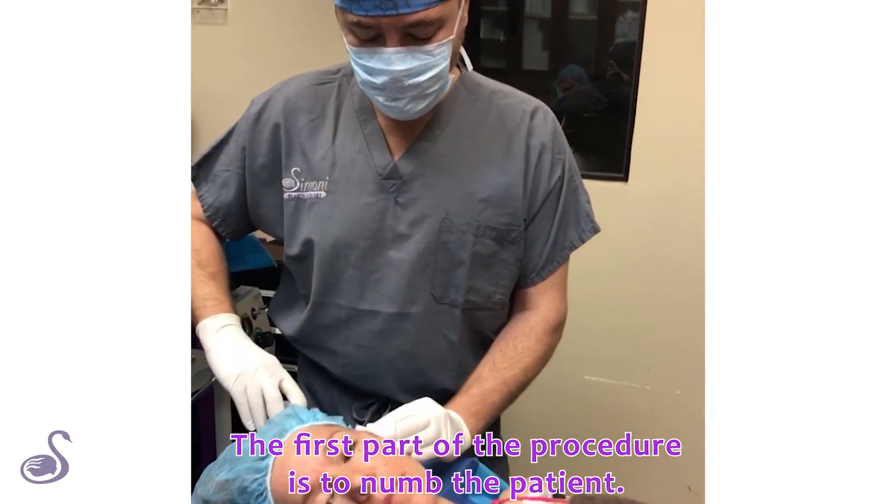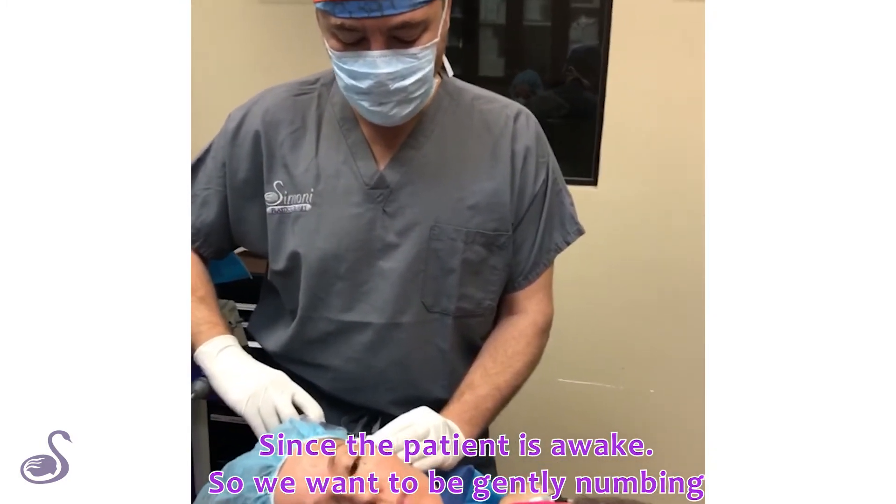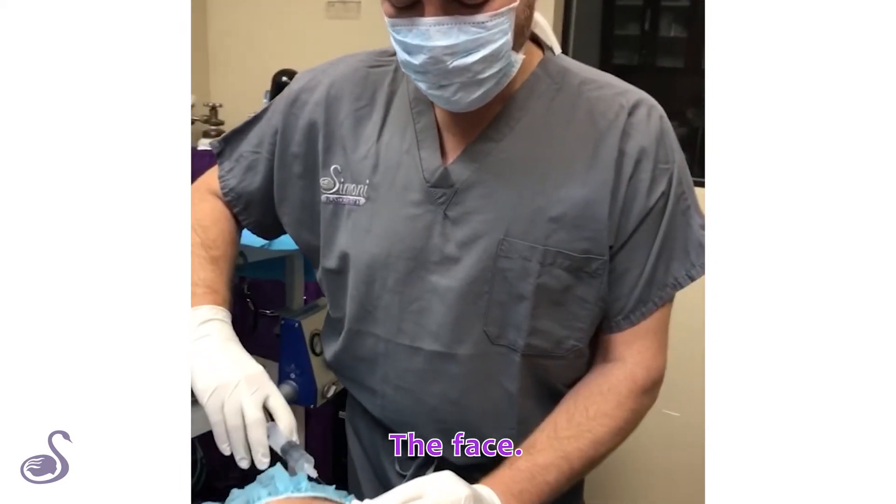The first part of the procedure is to numb the patient. Since the patient is awake, we want to be gently numbing the face.